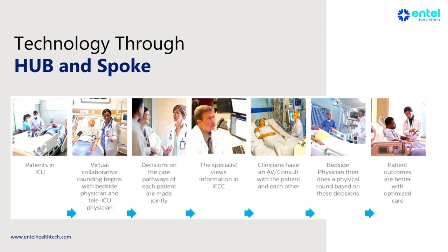So how does it work? This is a technology through hub and spoke. Suppose your patient is in ICU. We have installed all these things. Now what to install in Smart ICU, we'll see in the next slides. Virtually there are collaborative rounds with the on-site physician and tele-ICU consultants. Then the decision is taken through protocol-driven care and thorough discussion with the on-site physician. If the on-site physician is not available, you can guide the medical officer.